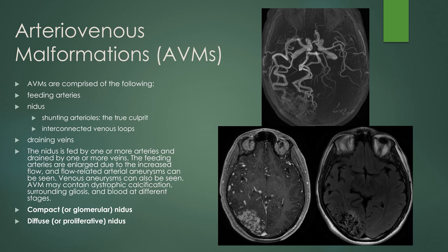This is an example of an AVM shown on MRA. You can see flow coming to it from the PCA and the MCA. You can measure this nidus — this would be considered a compact nidus. There's a little bit of gliosis in the tissue around it, as you can see on the FLAIR image.